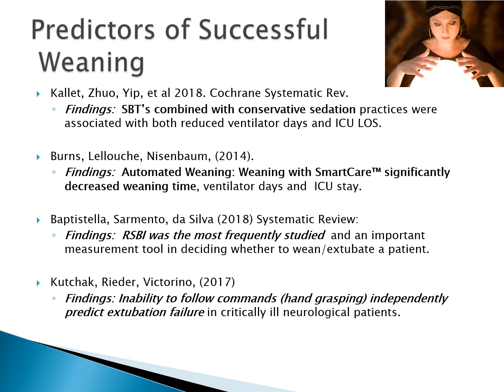Sometimes you can get patients that have really poor RSBIs, but the main reason they're breathing so quickly and skewing their RSBI is because they're anxious, too awake, or in pain. So the RSBI is good, but it's not foolproof, and it needs to be used appropriately in the appropriate environment and context.